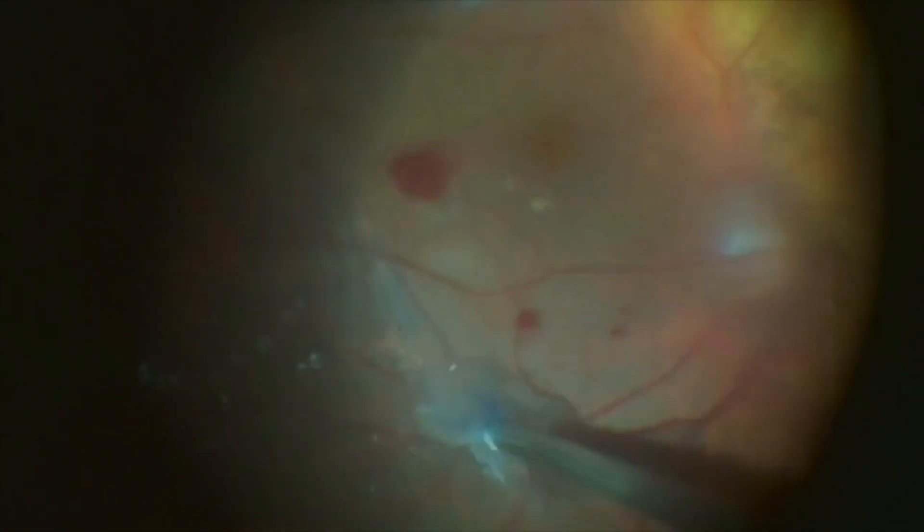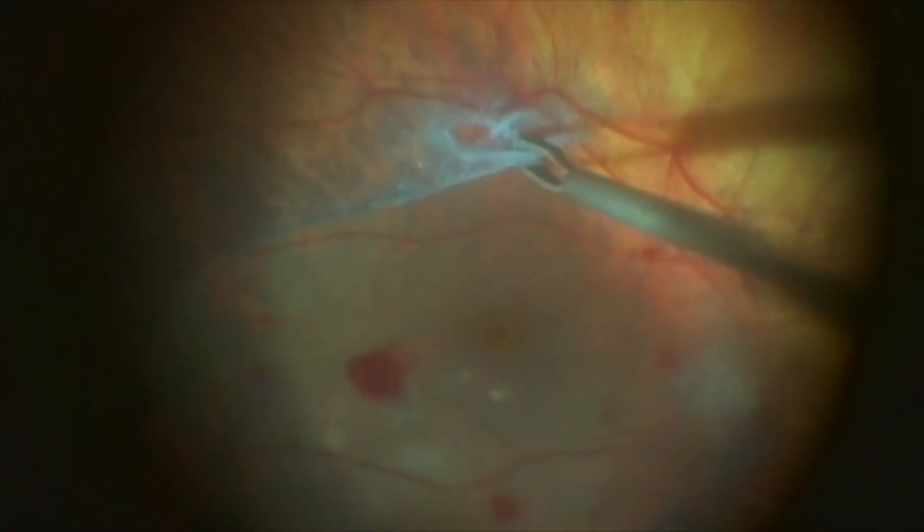This instrument is a good option to help the peeling in challenging cases like dense retinal membranes, difficult hyaloid detachment, and peeling in the detached retina.